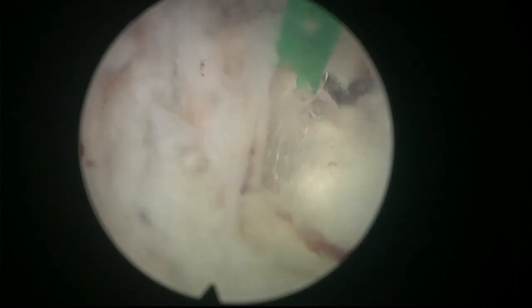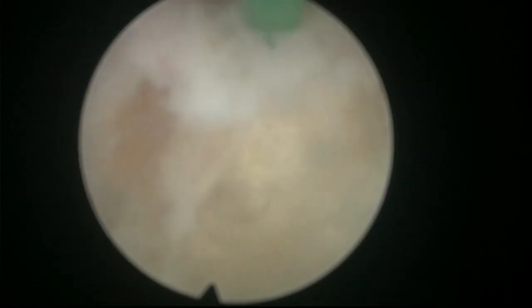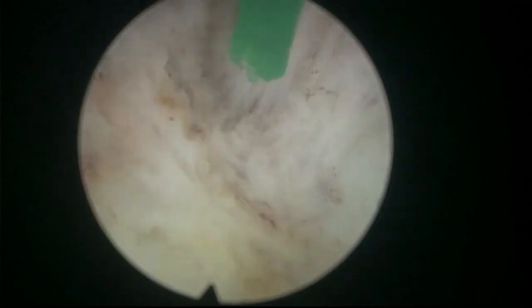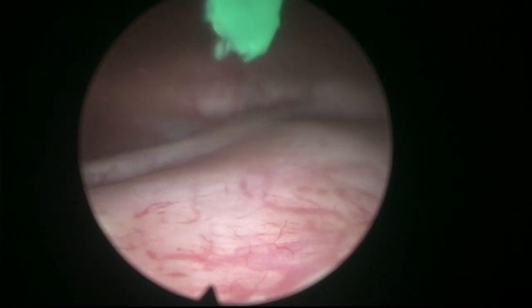My next step is going to be to try to, let's say, bring the bladder neck downwards towards the posterior aspect, but for that we have to release some of the lateral lobe. Still, there's bladder neck, you see, I'm trying to cut it. We come towards the sides of the middle lobe. The middle lobe is sitting on the middle, and we're coming at the lateral aspect of the middle lobe. Here, that's the bladder, and this is the UO, you see it's very, very close.